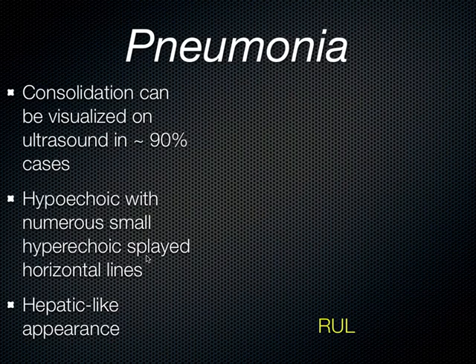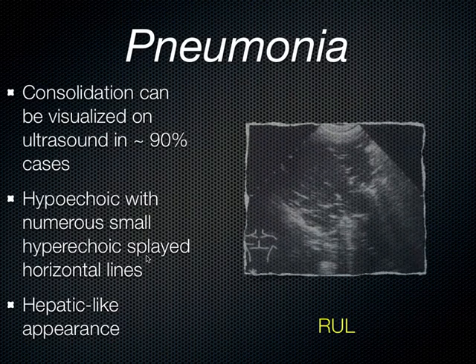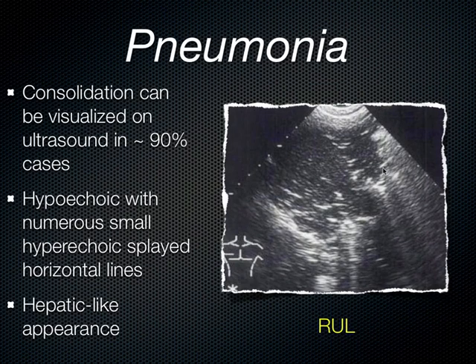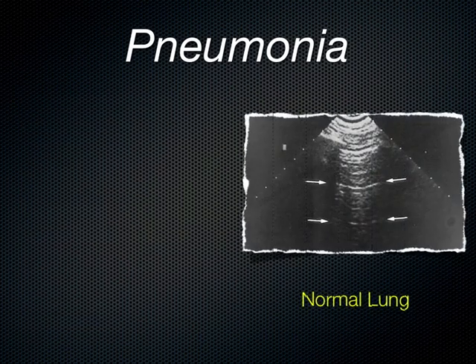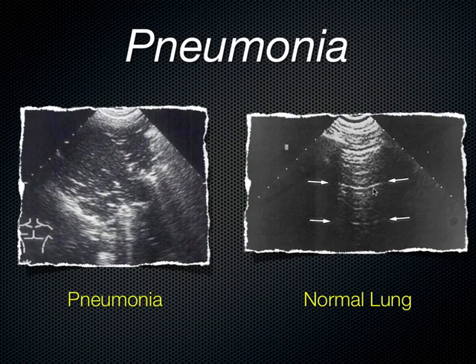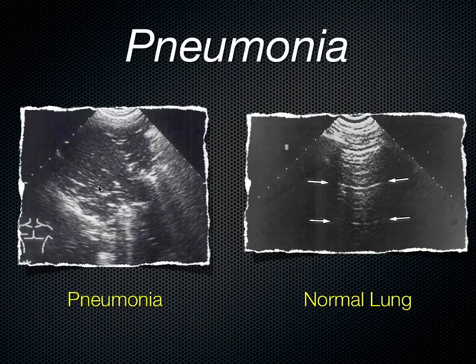A consolidation or pneumonia can be seen on ultrasound in up to 90% of cases. What you see is a hypoechoic area in the chest with numerous horizontal lines — hyperechoic horizontal lines seen throughout. When you look at this, it really does look like the liver. The term we sometimes use with ultrasound in pneumonia is hepatization of the lung. You can see the difference between normal lung with repeating A-lines coming down from the pleural line — caused by the sound-air interface — versus when we lose that artifact and see a consolidation or hepatization of the lung.